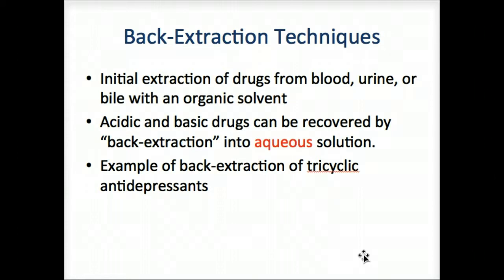Another approach to acidic and basic drugs is to recover them by back extraction into aqueous solution. In this case, there is a reduction in volume of the specimen for further concentrating and miniaturizing the procedure. One-step extractions can yield high recovery but can also not be very selective, since neutral substances are always present in one-step extractions. For chromatography techniques, it is best to use 3-step extraction: extraction, back extraction, and then re-extraction.